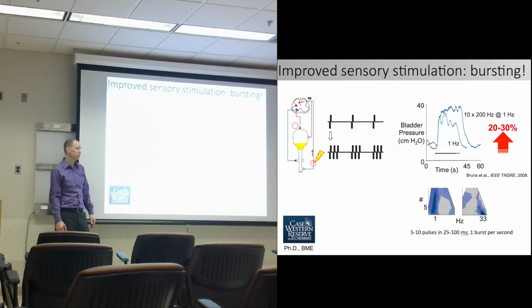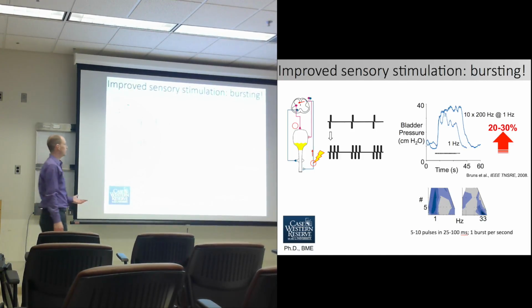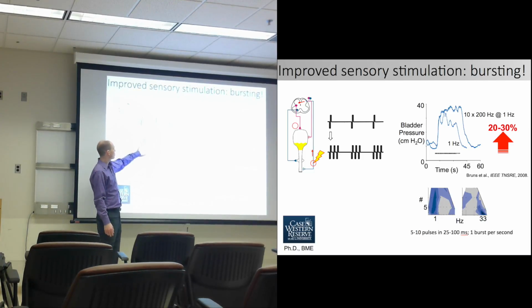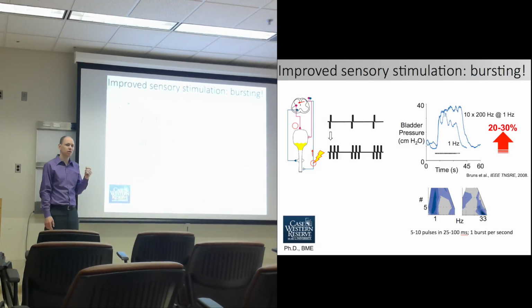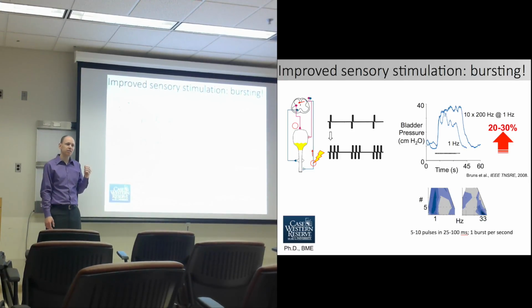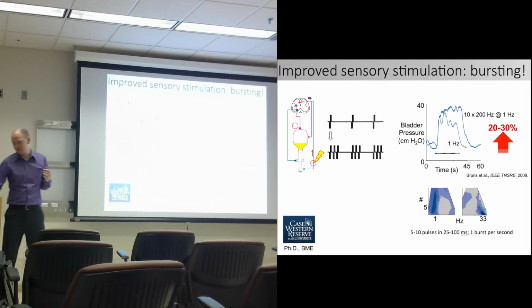The sensory nerves don't respond to this kind of chronic continuous stimulation pattern. So the thought we had was, can we do something where the stimulation is changing? Or maybe at least bursts of pulses, perhaps mimicking how the sensory signals naturally fire in bursts of action potentials in response to a changing stimulus. And fortunately for us, that worked.